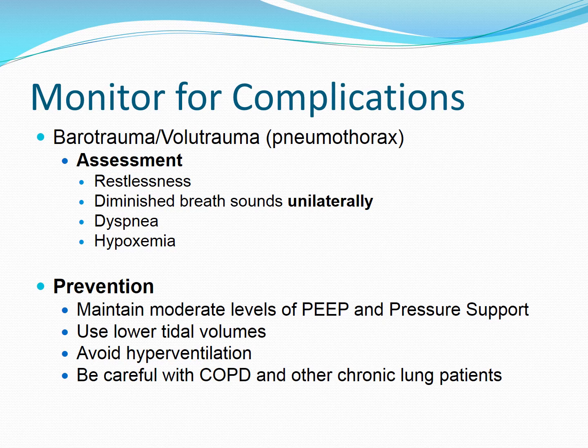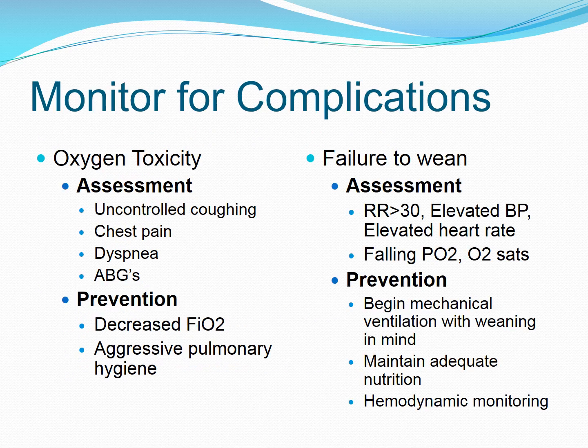barotrauma. The ARDS patient, their lungs are very stiff and hard, and so if we increase the pressure in those patients, we also have a greater chance of causing barotrauma. So those are some things that we want to do to help prevent barotrauma and volume trauma in these patients.